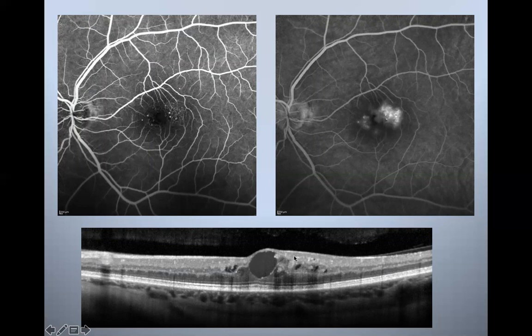And then on OCT, this is what you see. Because a lot of optometry practices use solely OCT and they're not doing fluorescein angiography, this is correctly identified as macular edema. But why is that leaking? What's going on? Why is there a large cyst? Why are there these little pockets of edema throughout here? Now, fluorescein angiography kind of gives us our answer. These microaneurysmal changes are very common in macular telangiectasia, and they continue to leak and cause the macular edema, obviously.